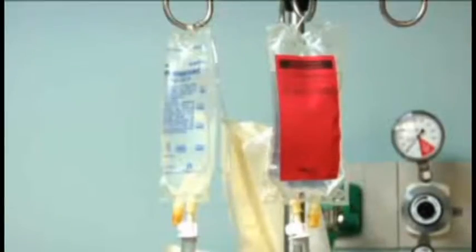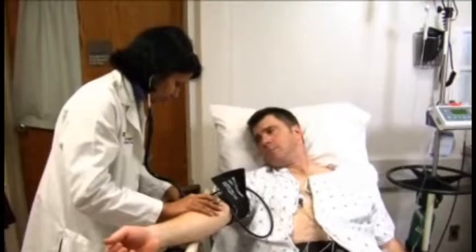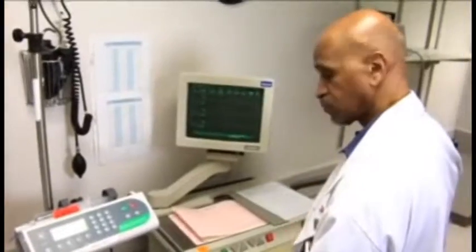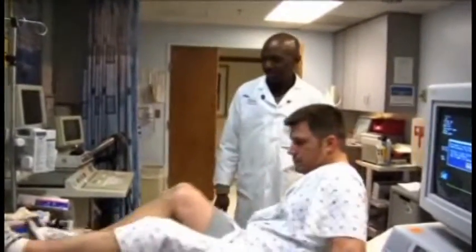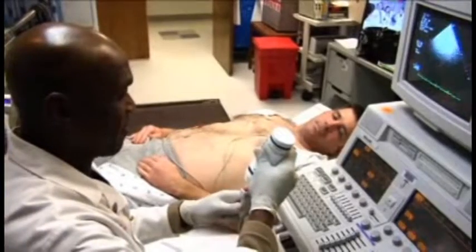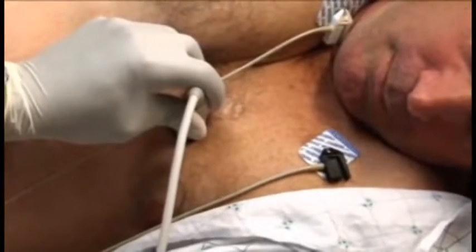An IV will be started to allow for the infusion of the dobutamine. A blood pressure cuff will be placed on your arm so that your blood pressure can be measured before, during, and after dobutamine infusion. Next, you will be asked to lie on an examining table and the sonographer, a specially trained ultrasound technologist, will obtain ultrasound pictures of your heart using a small, handheld transducer and water-soluble gel.